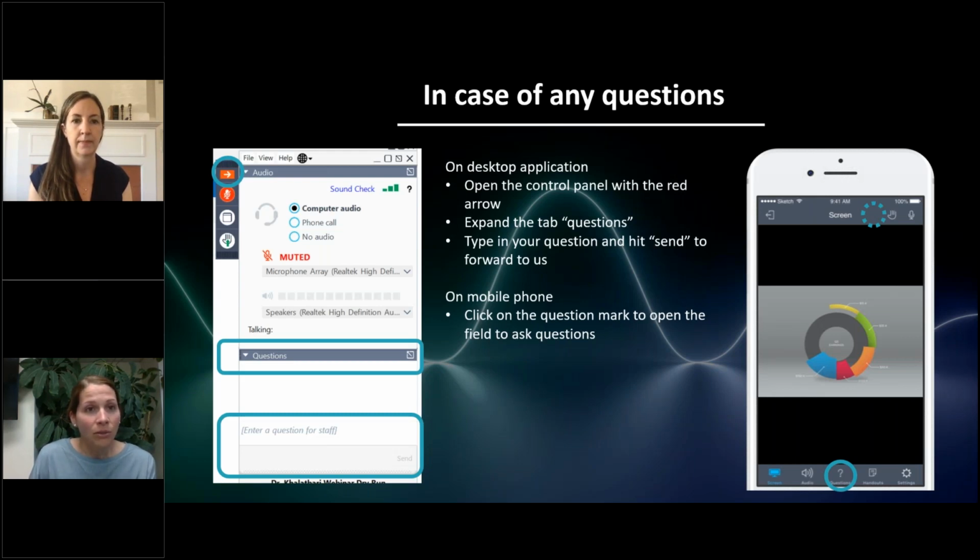Thank you. So the next question says, how does age affect the ERG and pupillometry responses, and does this contribute to the inter-individual variability? Yeah, so that's an important factor, as I mentioned with the pupillometry results, but it affects the ERG as well. So generally, as people age, the amplitudes of the responses go down. But there's also variability between individuals, and there's variability within individuals day to day. And so, again, when we're looking at a comparison between two groups, we can kind of average all of that stuff out. But when we want to take a tracing or a group of tracings from a single patient and then make a prediction about that person or a decision, we have to know how to take everything together.